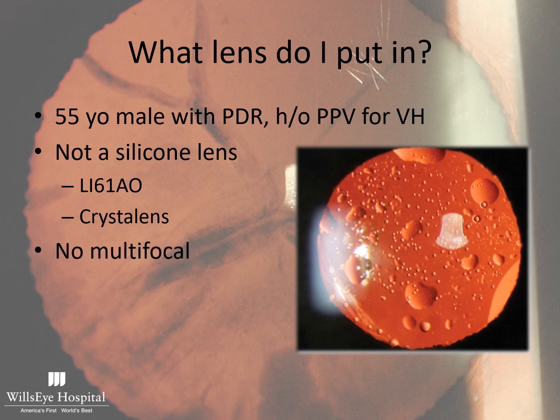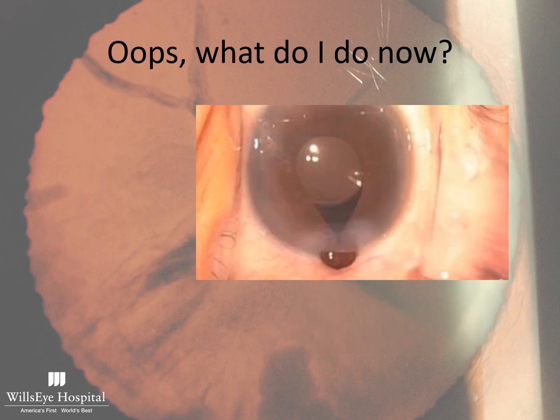I also avoid multifocals in these patients. You don't know how people with retinopathy like macular degeneration or diabetic retinopathy are going to progress over time. That's different than something like an ERM that's already been peeled or a mild ERM that could be amenable to peeling in the future. Somebody with potential progressive retinopathy over time, be again careful about multifocal IOLs. And I would suture the wound in this patient and talk to my retina colleagues if they think they're going to need to go back in.